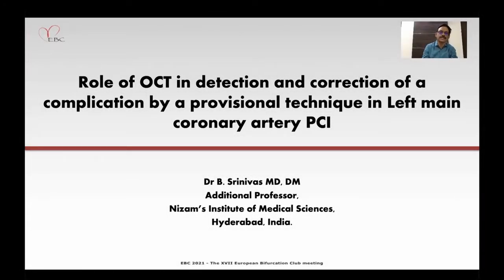The title of my presentation is Role of OCT in Detection and Correction of a Complication by a Provisional Technique in Left Main Coronary Artery PCI.